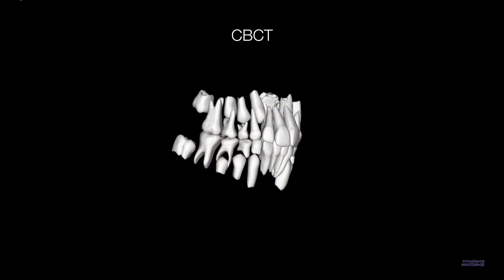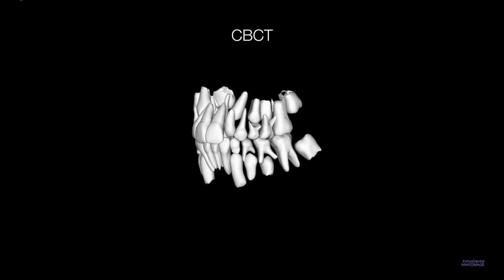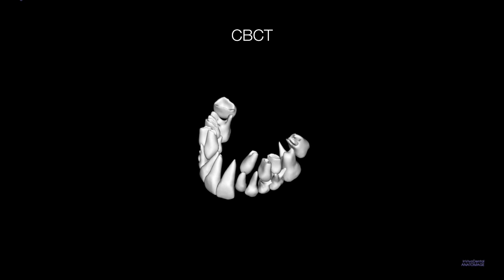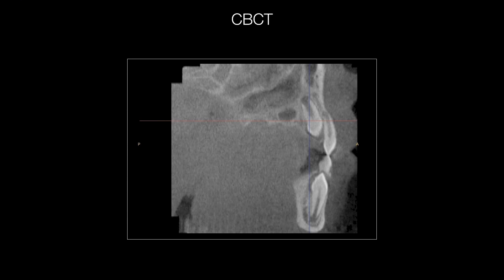And the cone beam image actually shows us exactly where this erupting canine is, and again gives us the information to treat this appropriately. And in fact, in a case like this, it's quite easy to tell that treatment of that lateral incisor would actually result in negative sequelae on the root of that tooth, and you would actually get yourself into more trouble by treating this case than by letting some development happen. And that's exactly what we did in this case.